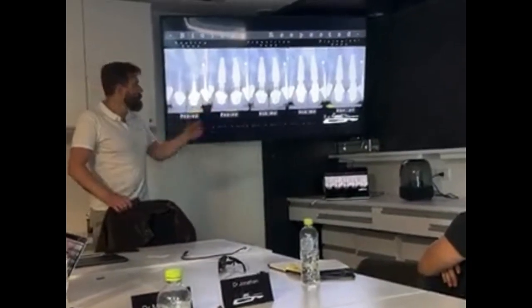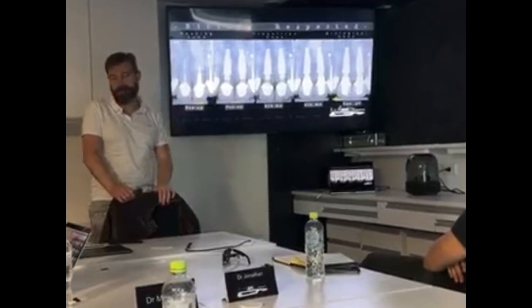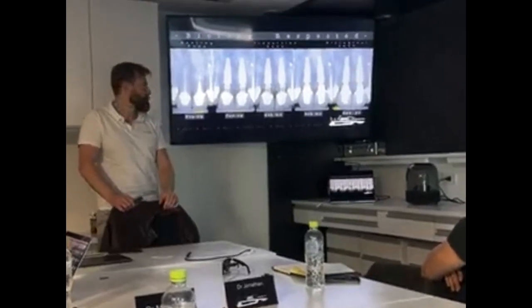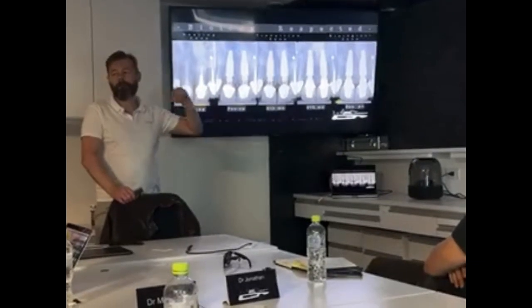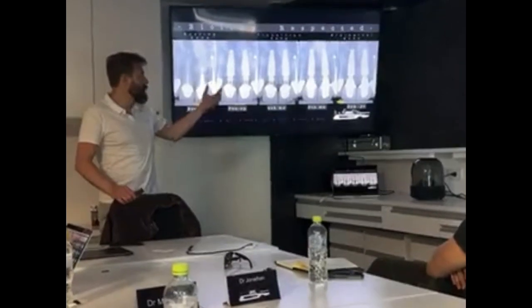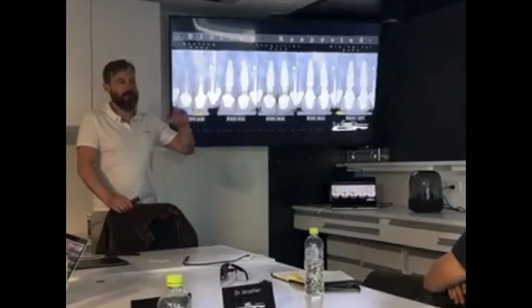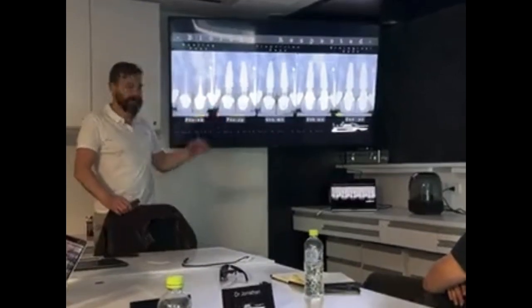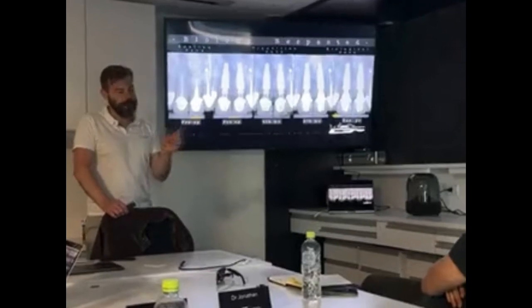I believe the way we see this arrangement between the bone and the abutment, as you see now here on the evolution of these X-rays, probably this case is going to endure for many years comparing to what we usually have of peri-implant tissue formation. This is not even zero bone loss concept. This is building up tissue inside the socket once you understand.